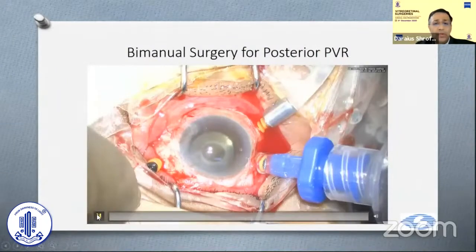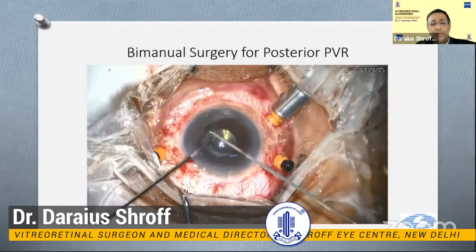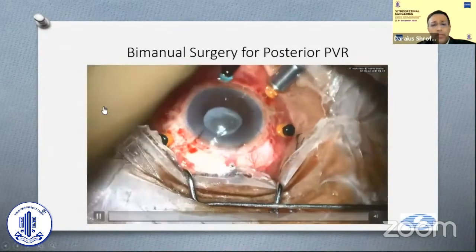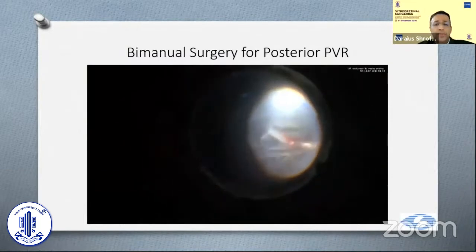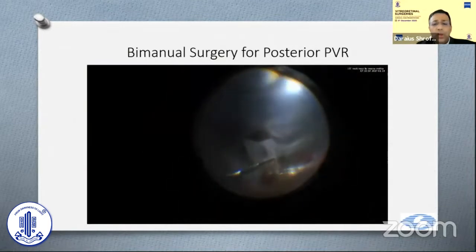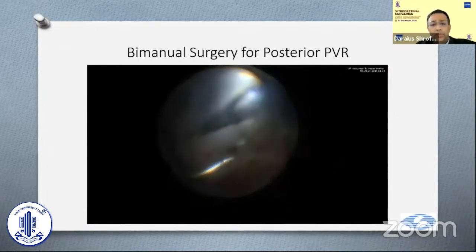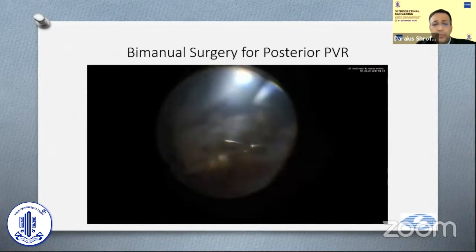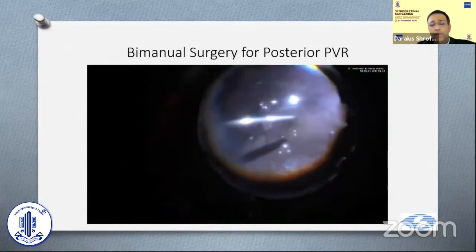In this first video, we did bimanual surgery for posterior PVR. First we removed the oil, and there was some anterior capsular phimosis preventing view of the retina — visualization is the key in these cases. We opened that up and placed the chandelier, which dramatically improved the view and allowed bimanual surgery. We found the cause of traction was a napkin ring-like subretinal membrane. Bimanually we pulled — with both hands using the hand-upon-hand maneuver — and although there was a retinotomy, this adherent membrane was removed in toto, releasing all traction causing the stiff retina. The retina was apposed and we lasered it.